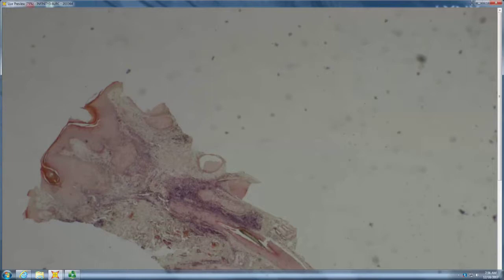So this, we're not seeing much fat at all. What are we seeing? Some hair follicles. Hair follicles. And where does the inflammation tend to reside? It looks a little deeper. Not that isthmus or infundibulum, but it's not peribulbar. Well, infundibulum would be here. That's about isthmus. So it's an isthmic, which makes it sound like you're lisping. You have hyperkeratosis, follicular plugging, you have some interface, you have a dense isthmic infiltrate forming sort of vertical columns of lymphs. So like a lupus. Lupus. Very good.